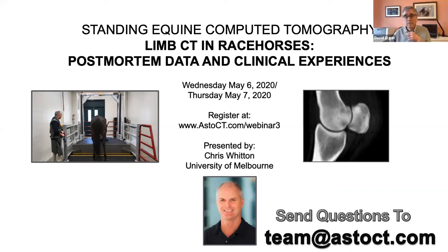Another question that was asked just now: have horses kicked the machine? Yes, they have. Not by touching their belly. We have so far not had any horses have the machine touch their belly, as the scanner really stops right in time, but we have had horses kick during limb scans, and this machine survived, as well as the horse survived, as well as all the people survived. So far, no casualties whatsoever.